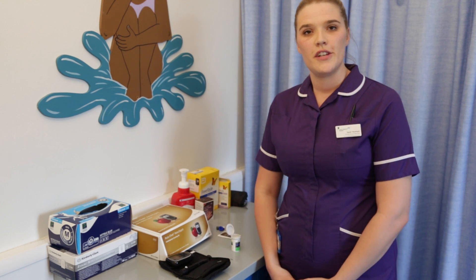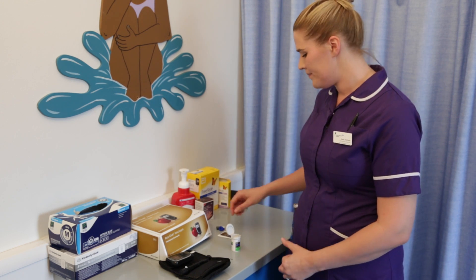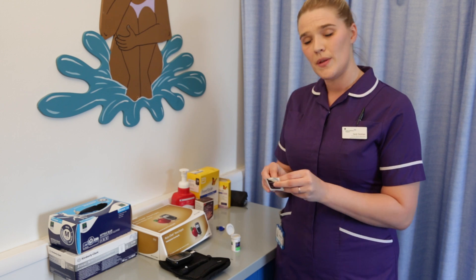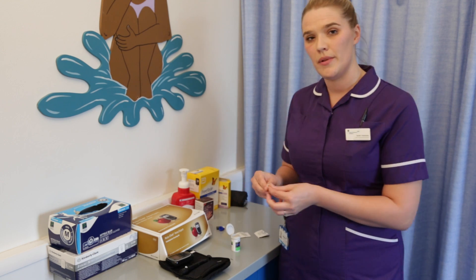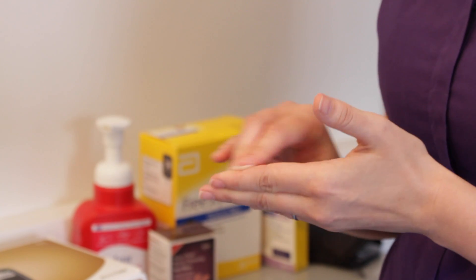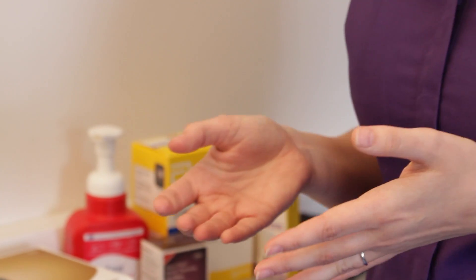First and foremost, before checking a blood glucose level, it's really important to wash and dry your hands. For this I am using a hand wipe, and if you are using hand wipes at home, please make sure that they don't contain any alcohol, as alcohol wipes can affect the blood glucose reading. You can also use soap and water. Once your hands are fully clean, give them time to dry.